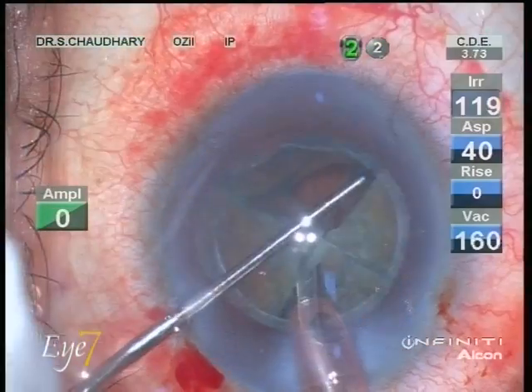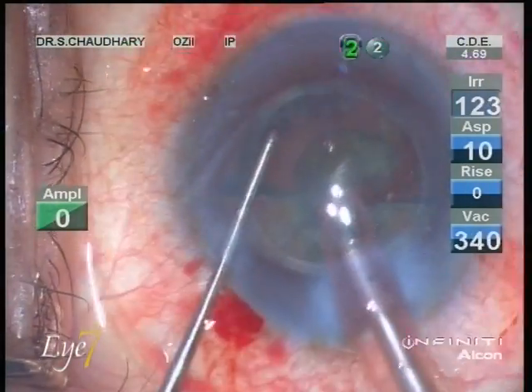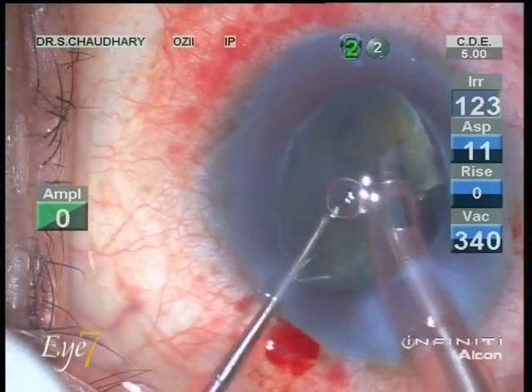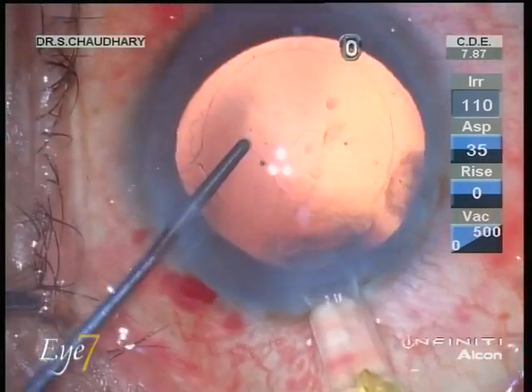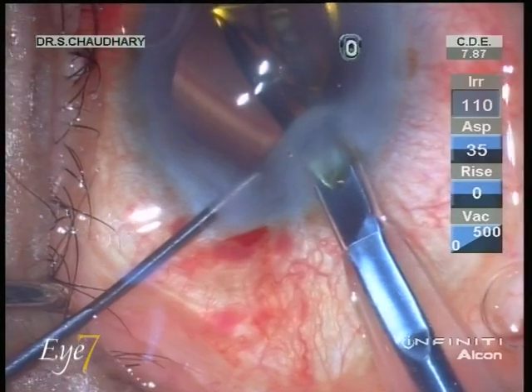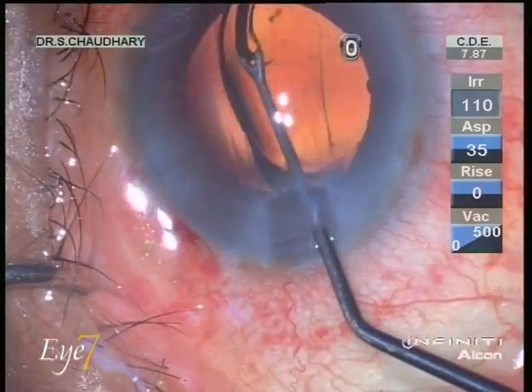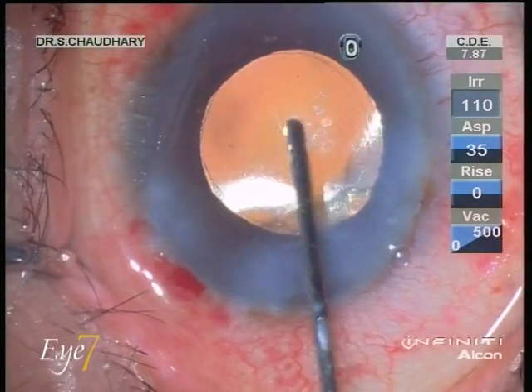The first fragment is gone. We dial the nucleus, pick up the second fragment, emulsify it, and then the third and the fourth. The process has become very simple with the help of a femtosecond laser — surgical skills required have reduced and accuracy has increased. Now we are putting in the Monarch IQ IOL through this 2.2 mm incision. The lens opens up within the eye, and once it settles down in position, you can see the edges being overlapped by the edges of the CCC — a perfect overlap.